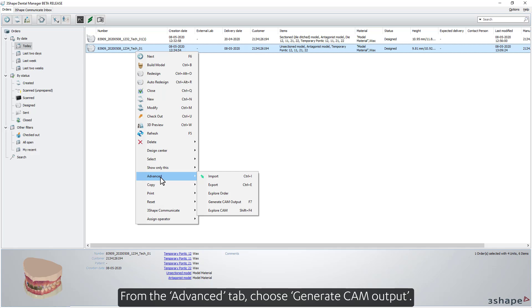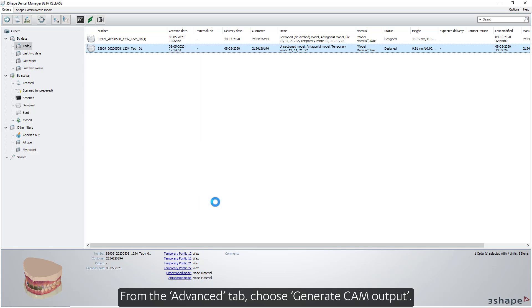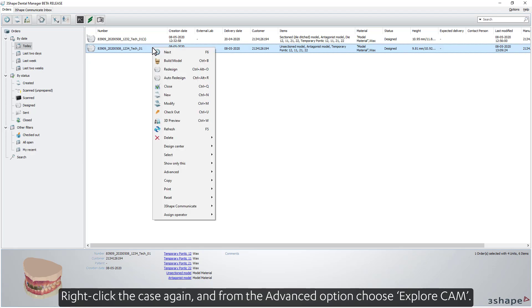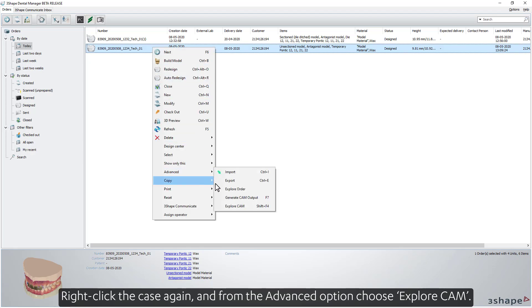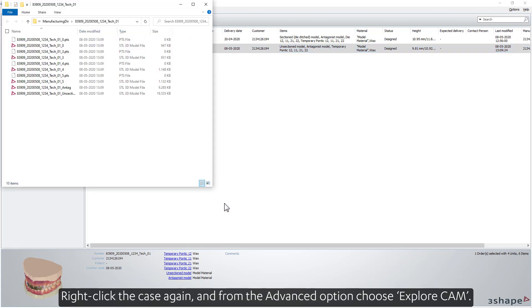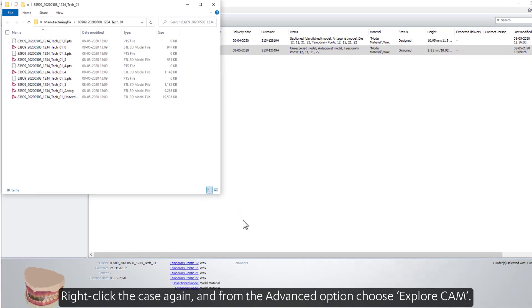From the Advanced tab, choose Generate CAM Output. Right-click the case again, and from the Advanced option, choose Explore CAM.